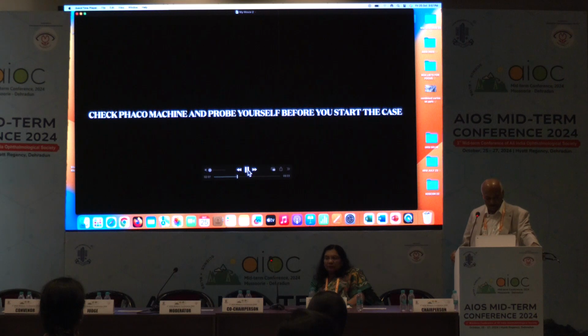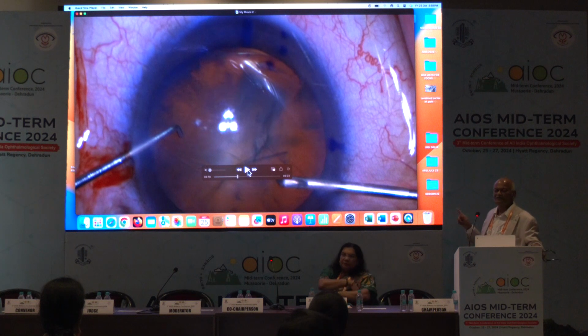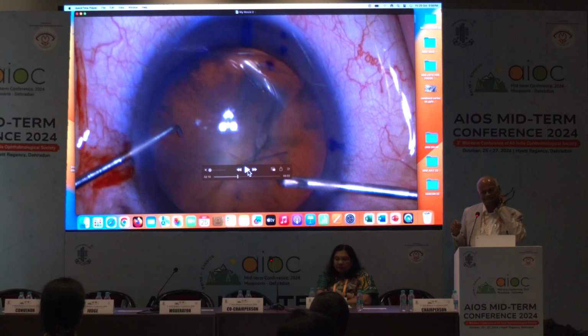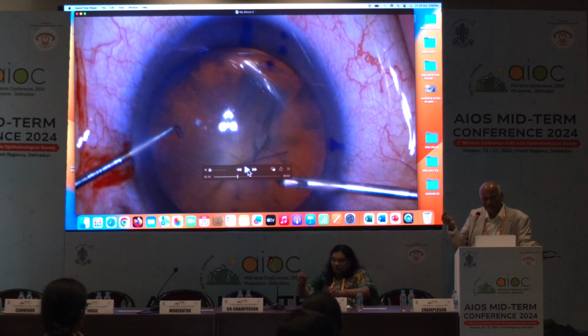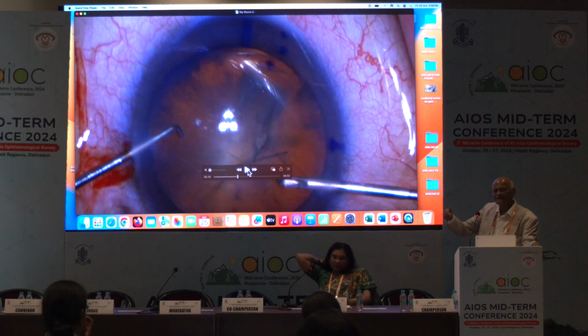So whenever you are going to do phacoemulsification, what is the lesson here? What will you do? Anyone? For every phaco, you will see that your sleeve is not torn, and from outside you check whether water is leaking or not. Secondly, you will again check by your hand, this phaco tip, whether it is correct or not. Yes, Raghav, what you said is correct.